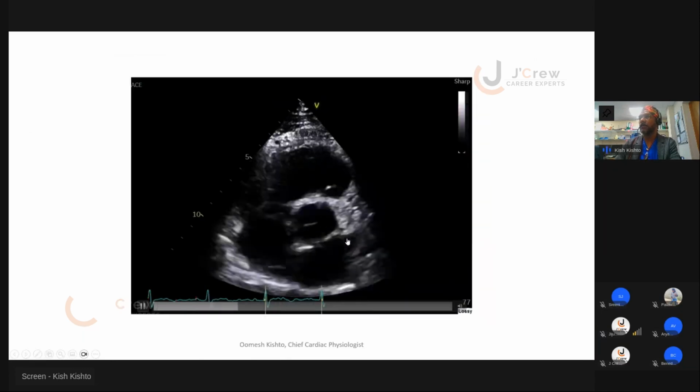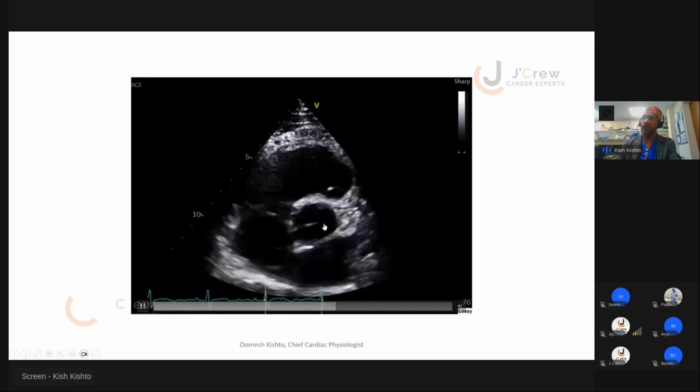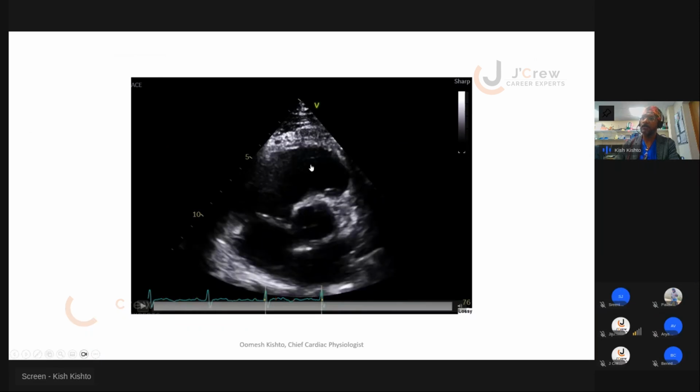so then we go short axis. Short axis, if you go up basal up to the aortic level, you're going to see your tricuspid and aortic valve, RVOT, your PA there, the tricuspid, and this is your interatrial septum there, and your appendage sometimes around here.